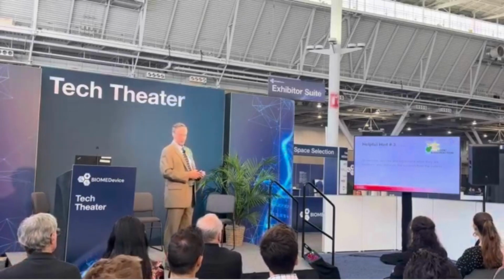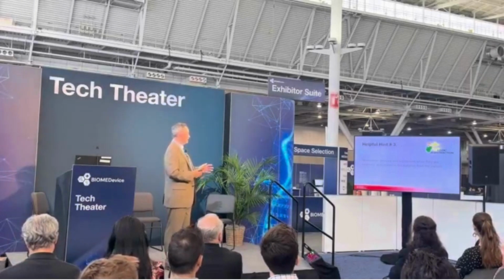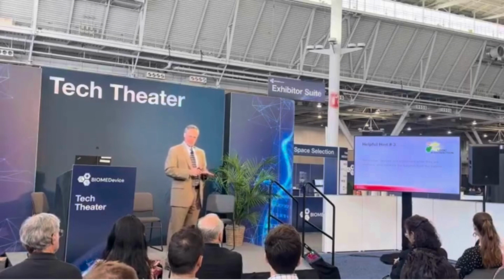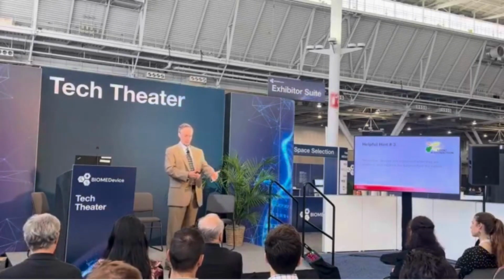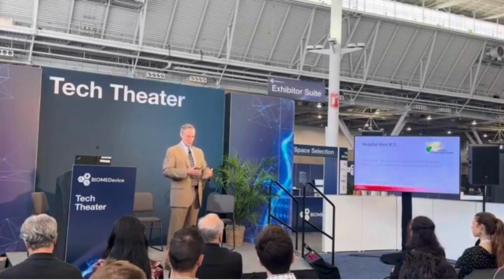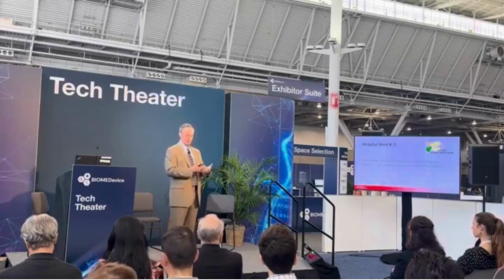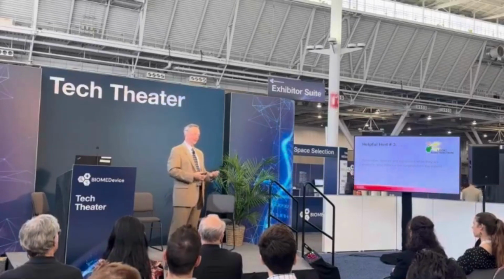My last helpful hint, which we go home disappointed. Everything that we work on are enablers, but they also can distance the user from the patient. Surgeons go into medicine to be part of the patient procedure, element, experience. So everything that gets introduced, you don't want it to get in the way of what they're trying to do.